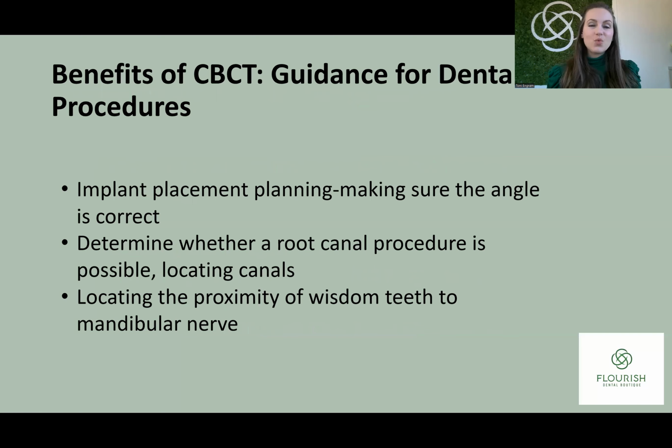And of course, we use the CBCT as a guide for certain dental procedures. For instance, in implant placement, the surgeons will often do a CBCT first to plan exactly the direction that the implant is going to go, to make sure the angle is correct in all dimensions.